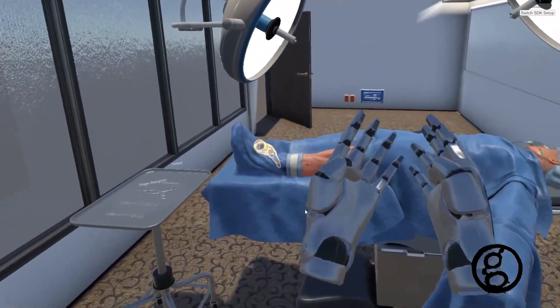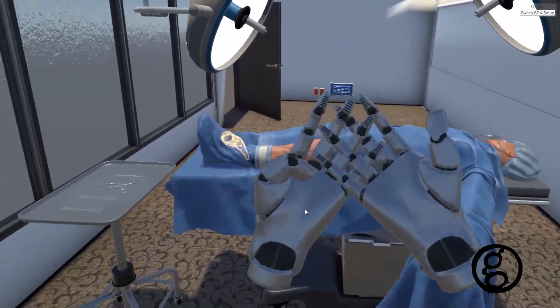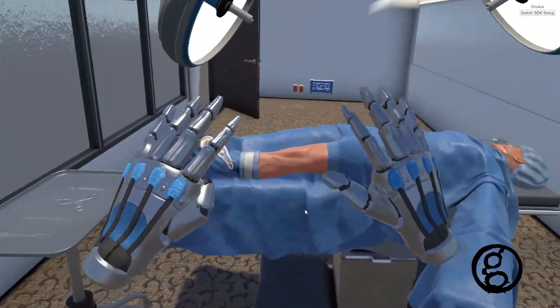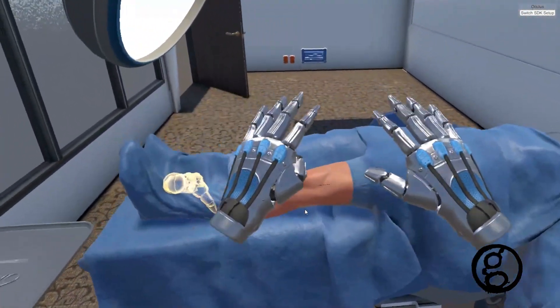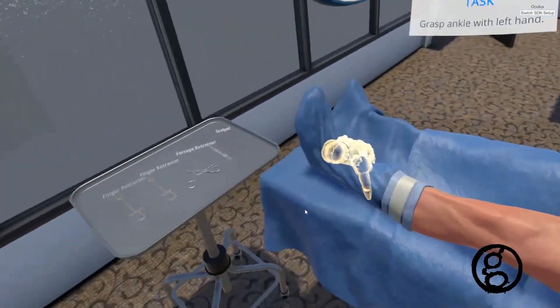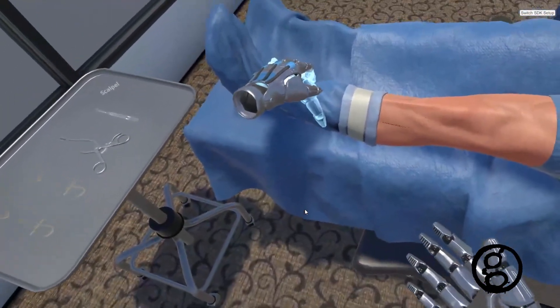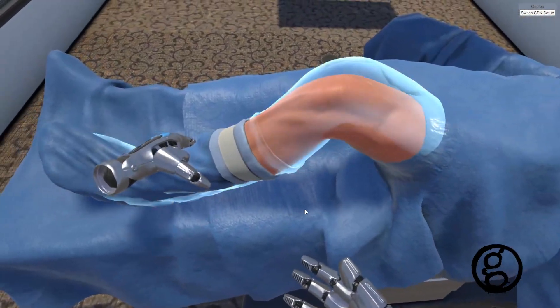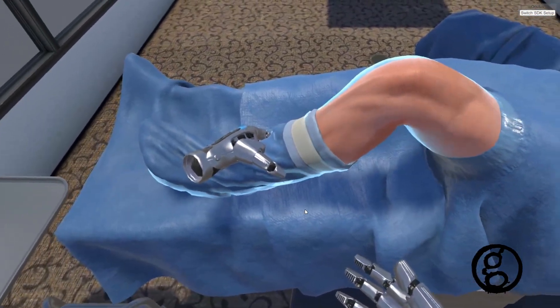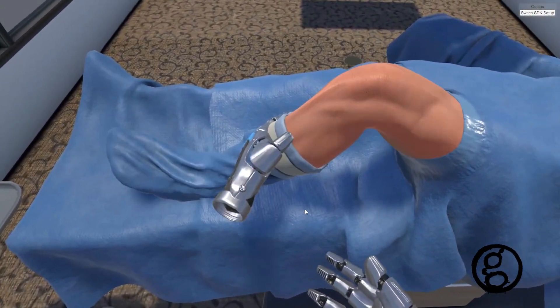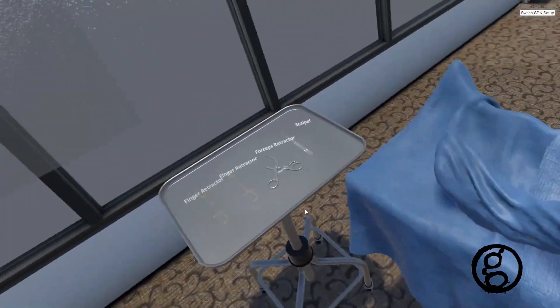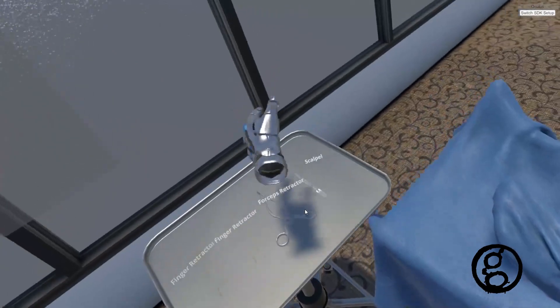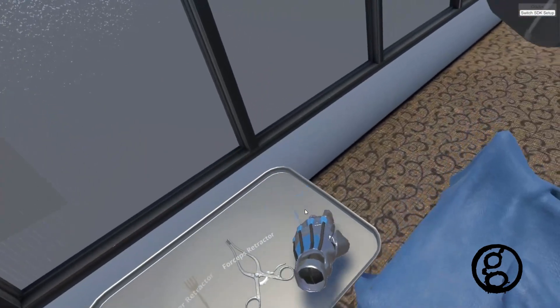Grasp the patient's left ankle, preferably with your left hand. Now manipulate the leg to reposition the knee into 90 degrees of flexion. Select the scalpel from the Mayo stand to your left.